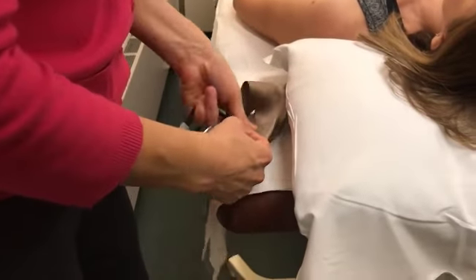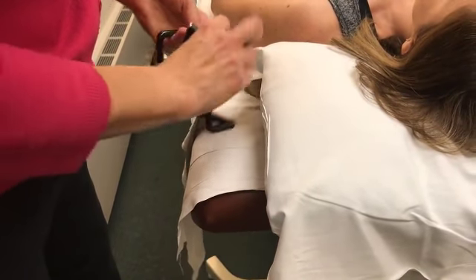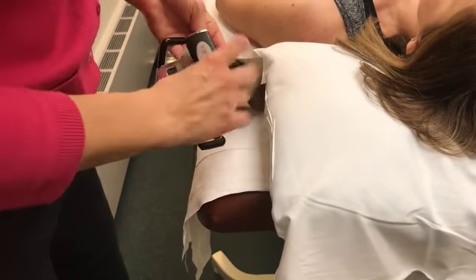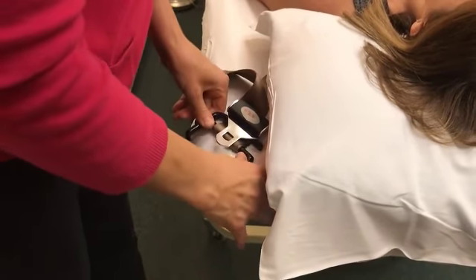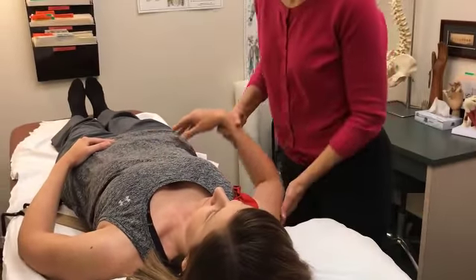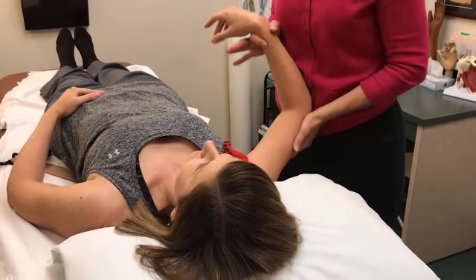Then you take the adjustable side and you cinch it up. You come in, you keep the tail with the main portion of the belt, and you come back on itself and lock it in place. You ask your patient to scoot over, and now you are all set to perform your mobilization techniques, and your patient can stay relaxed and you know that their scapula is stabilized.